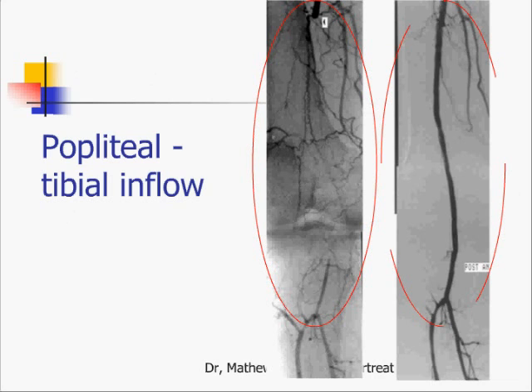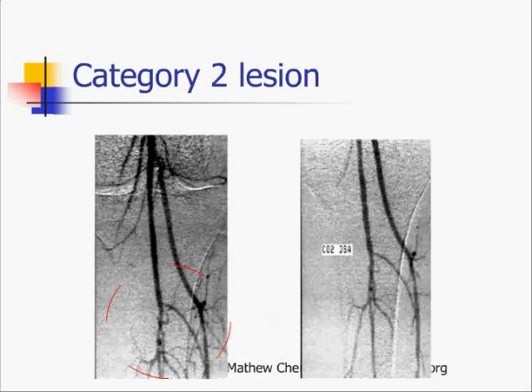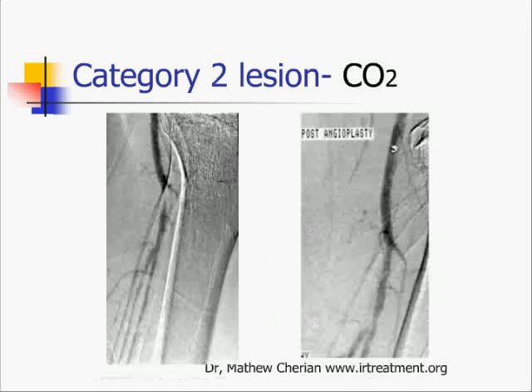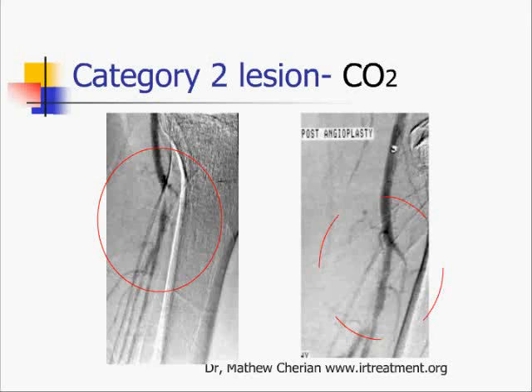Here is a popliteal inflow occlusion and the results after angioplasty. This is a category 2 lesion which was treated by plain balloon angioplasty. This is another tibio-peroneal trunk stenosis, category 2, which was also treated by angioplasty.